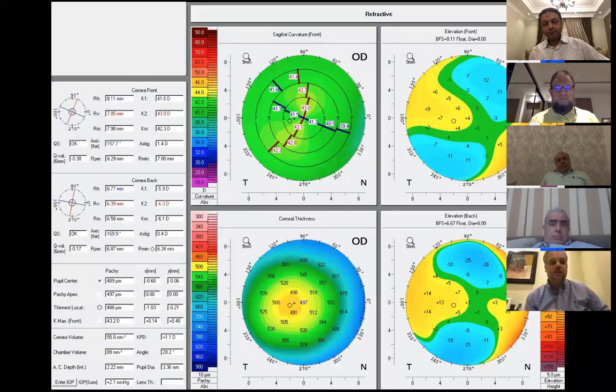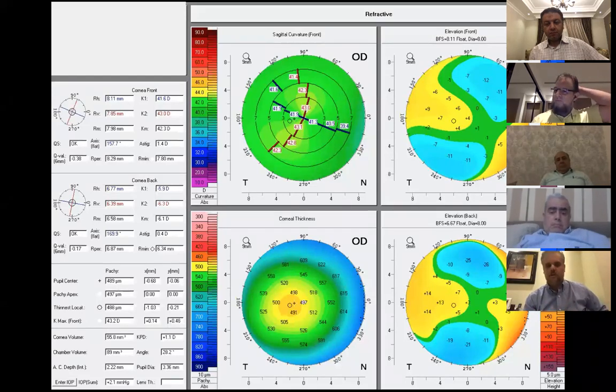And if we multiply by 1.2, we'll have +6.3. In this case, if we add 6.3 to the Kmax, we will have 49 diopters in Kmax, and it is acceptable, I think. In doing LASIK, I will try to center on the visual axis and not on the pupil. And I think in this case, we can go for LASIK even if the pachymetry is less than 500, as we will not ablate in the center. I think I will do it. I did some cases like this, and I will do LASIK in this case, no problem.